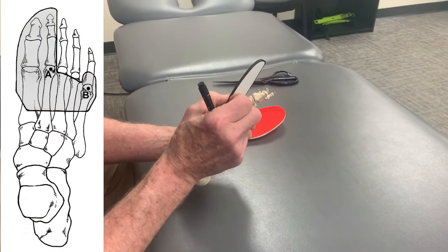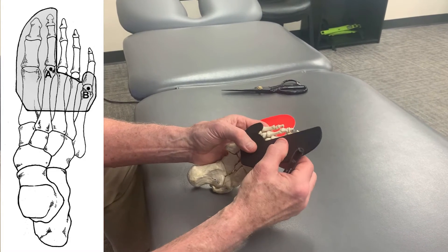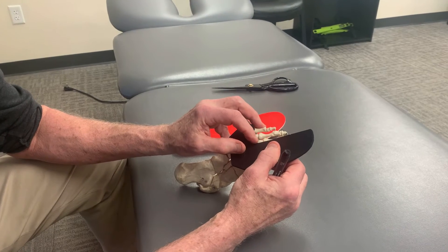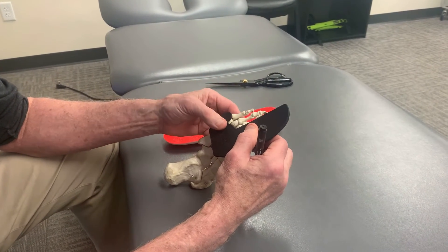The nerve, when you go off, this is thick enough and it's made out of an EVA rubber that lifts up the neighboring spots to offload where the nerve is getting compressed. This is really nice because, again, this is a very difficult condition to treat.